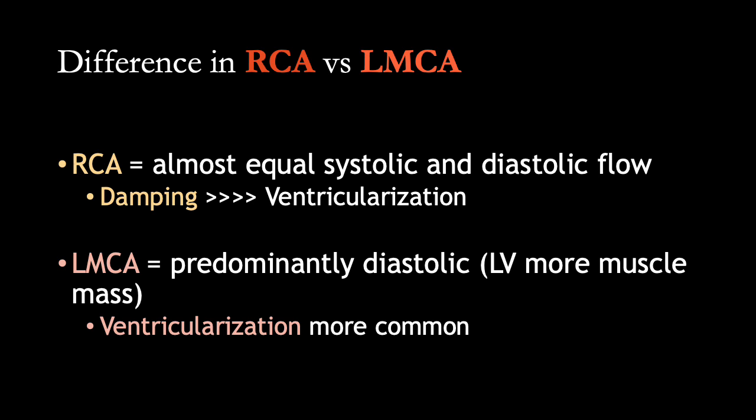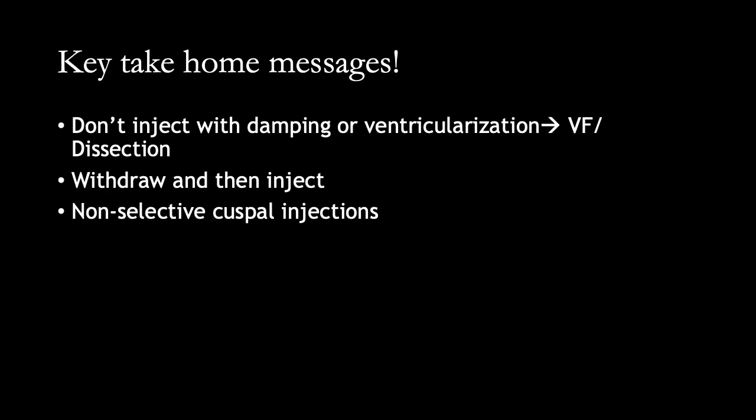Both of these are commonly seen in the cath lab. The pressure damps on engaging the RCA, whereas it can become ventricularized on engaging the left main coronary. The most important message is that no further contrast injection should be made when damping or ventricularization is present.